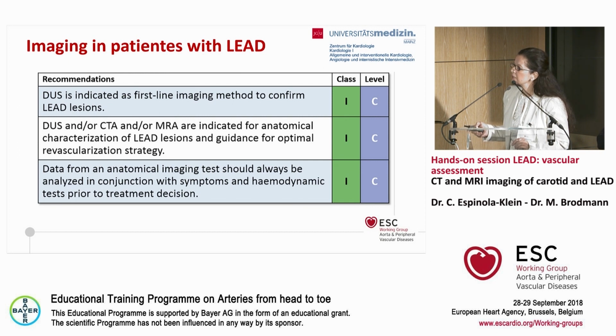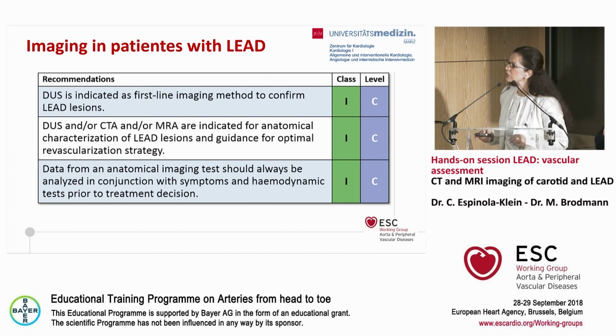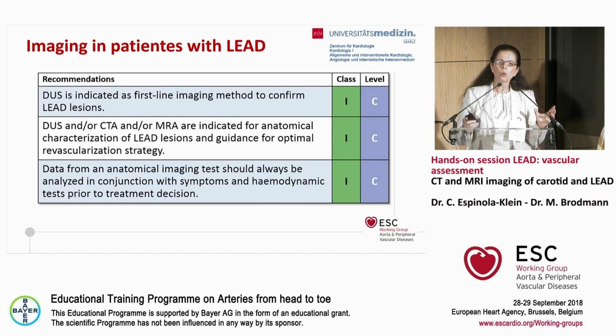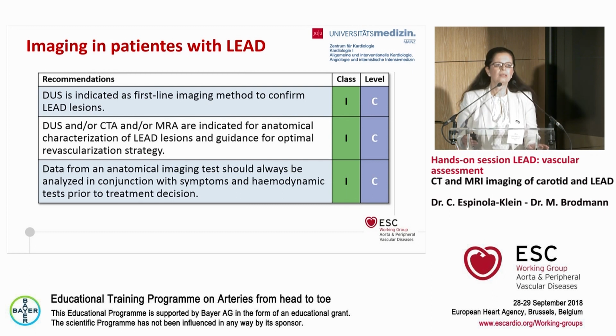But in addition, there are some indications if you have to know the exact anatomical structure of the lesions, in particular if you plan a revascularization strategy and if you plan a discussion of the cases, for example, in your vascular board. And this is the indication to perform imaging.